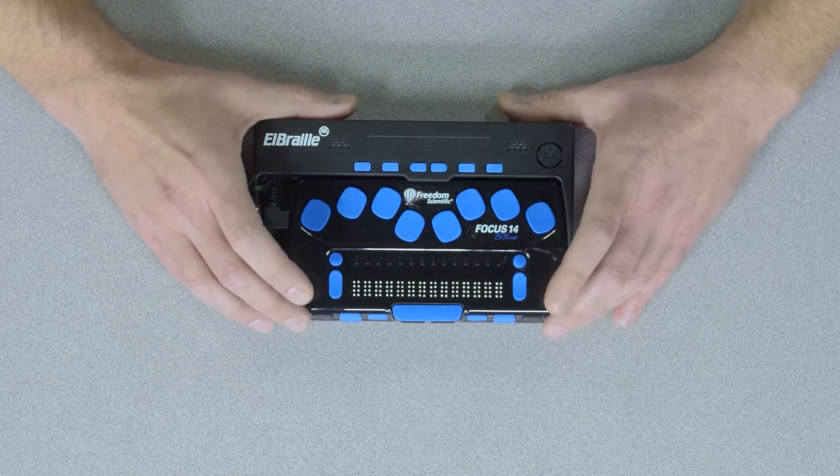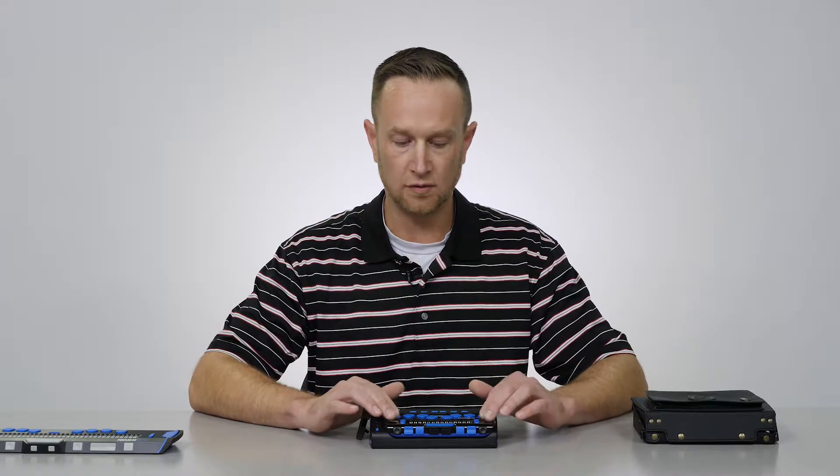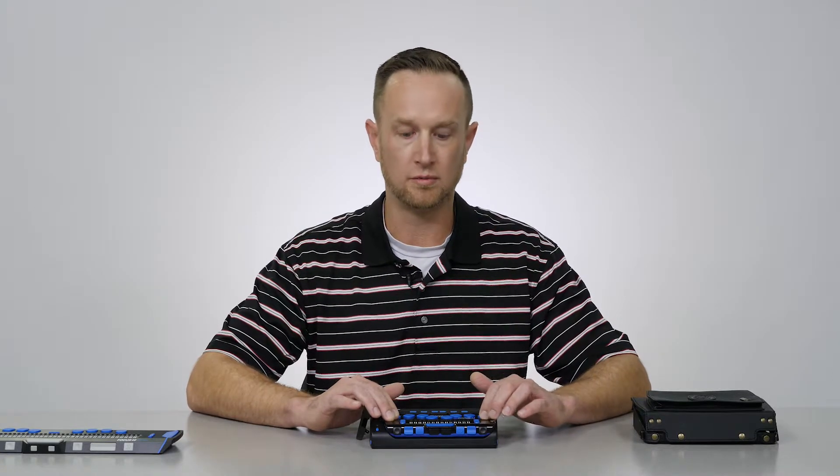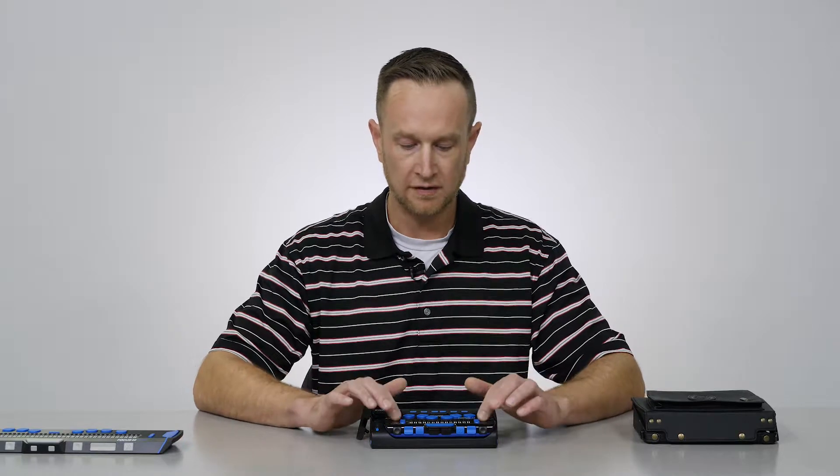It can connect wirelessly to your iOS devices, to your portable devices, and so it has always been a really nice portable refreshable Braille display on the go that can work with your portable devices. It has a nice little carrying case and great battery life. So that is the Focus 14 Blue Braille display.